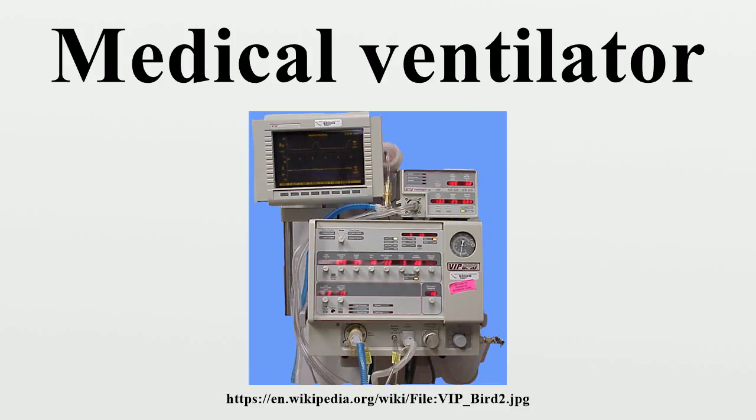History. The early history of mechanical ventilation begins with various versions of what was eventually called the iron lung, a form of non-invasive negative-pressure ventilator widely used during the polio epidemics of the 20th century after the introduction of the Drinker respirator in 1928.